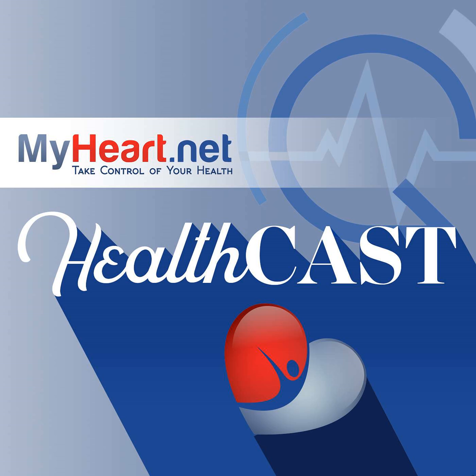That's number one. Once we decide that the patient is ready to come, these patients preferably should take beta blockers. We advise at least 2 to 3 days before. It's not just to decrease the heart rate, but also what we found is that even in patients who have a lower baseline heart rate, if you give a beta blocker, the variability which can occur during image acquisition is lower. So that is quite important for getting a good scan.